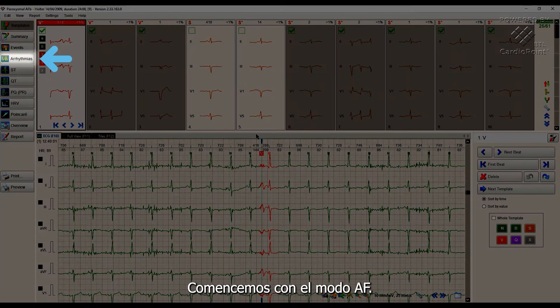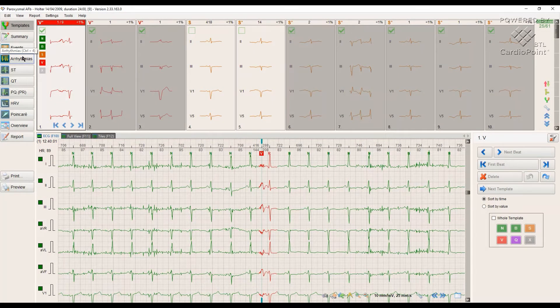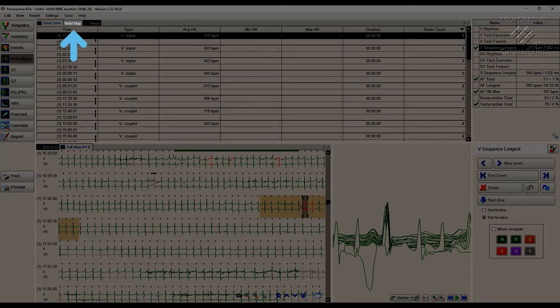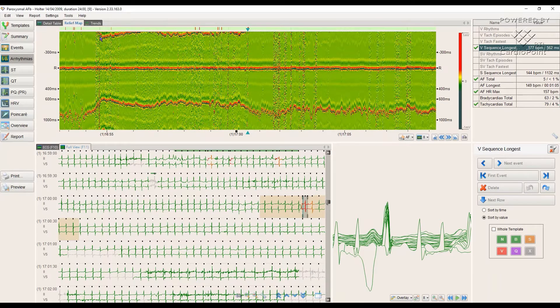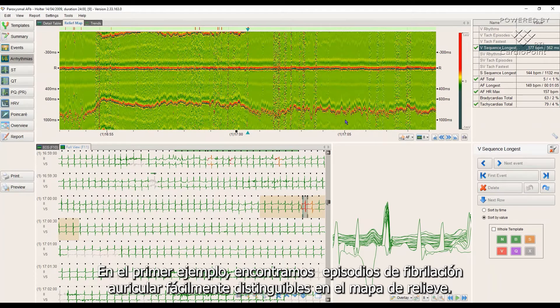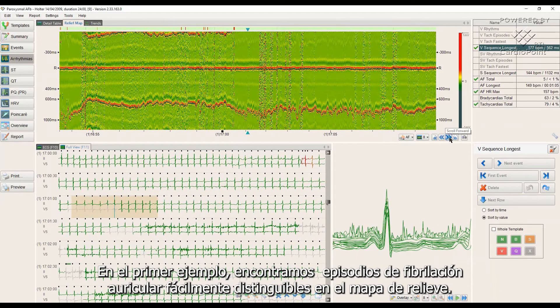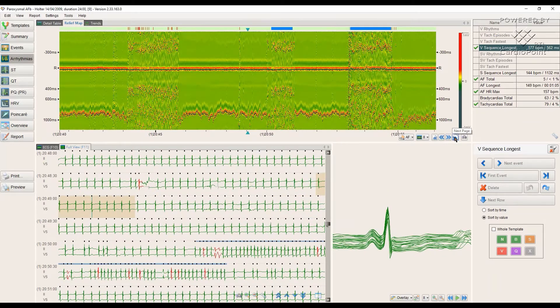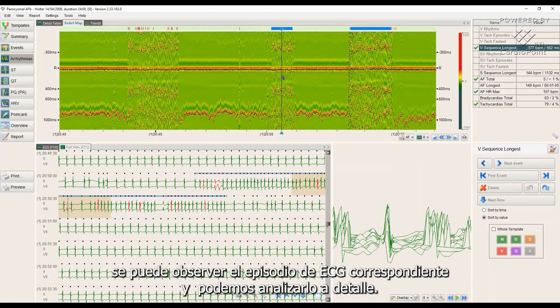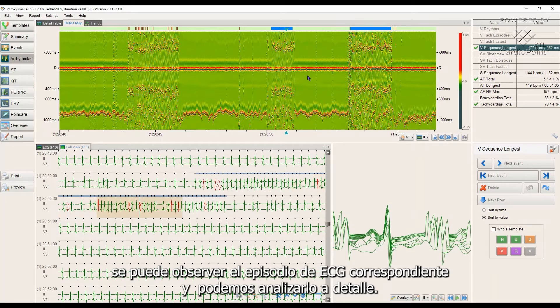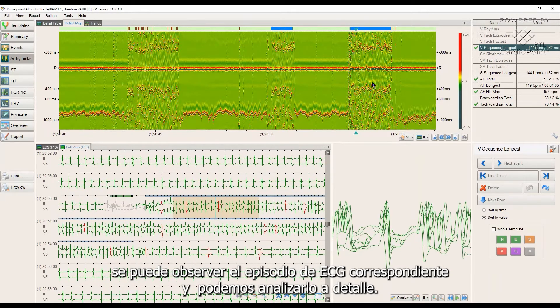Let's start with the AF mode. In this mode we see 10 minutes of cardiac activity at once. In the first example, we find episodes of atrial fibrillation easily distinguishable on the relief map. By clicking on an area on the relief map, the corresponding ECG episode can be observed and we can analyse it in detail.